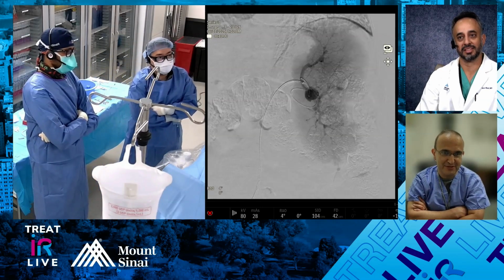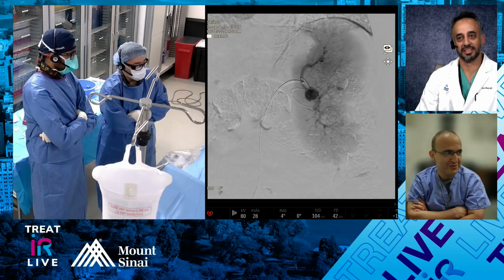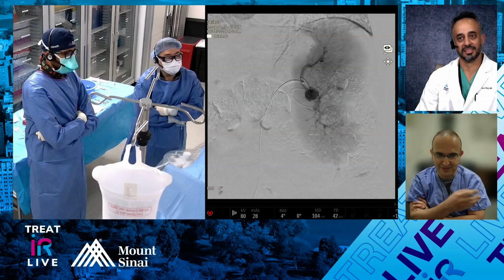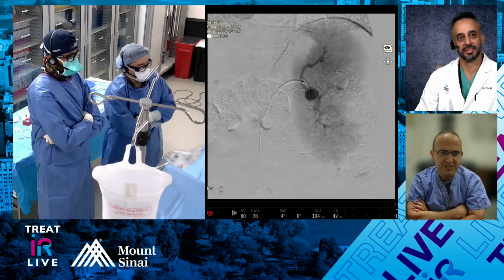I wish we got some aneurysms proximal to a stent graft. I think in our whole life we had one case where we could put a stent graft across the proximal aneurysm. And most of the time, like you said, especially in these patients, they are in the middle of the hilum. So, yeah.